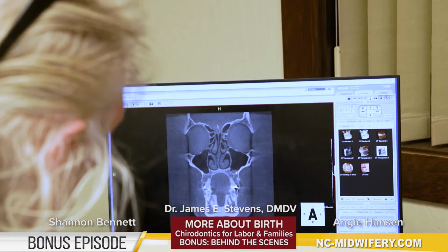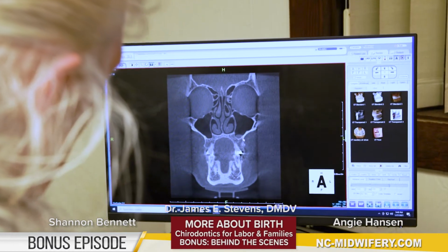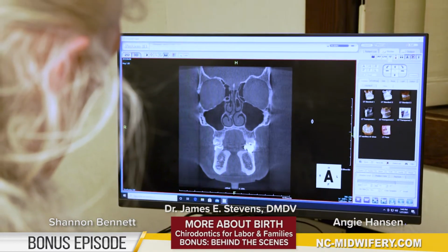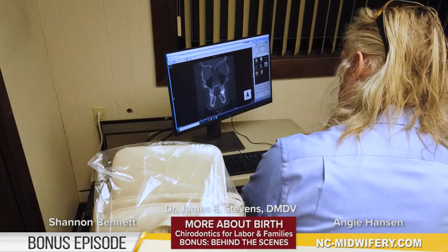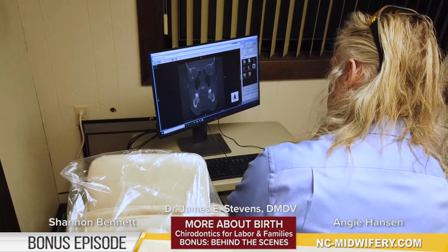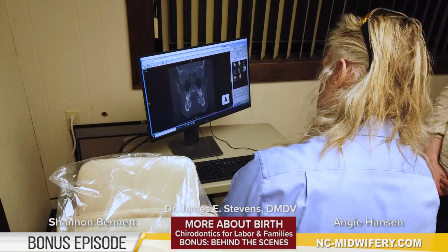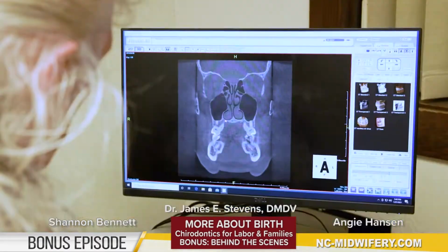Here, as I'm looking, we see this inflammation right here in the sinus. The patient most likely doesn't even know that they have that. We'll sometimes see these sinuses totally filled up, one sinus totally filled up, like that one little piece was. Now we're going all the way back. This airway should be 3 millimeters. Let's see what 3 millimeters looks like.